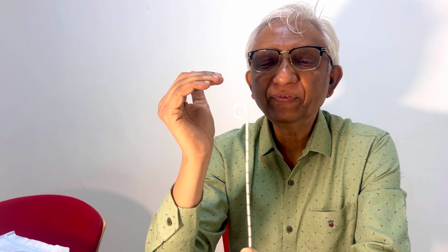Also, we have said that these have got interesting uses. It has got these markers which allow you to measure, and you can know the absolute length from the renal artery to the aortic bifurcation, or from the bifurcation to the iliac bifurcation, from the internal and external. So remember, whenever you want to measure, you have got this choice. Have you got it? Right.